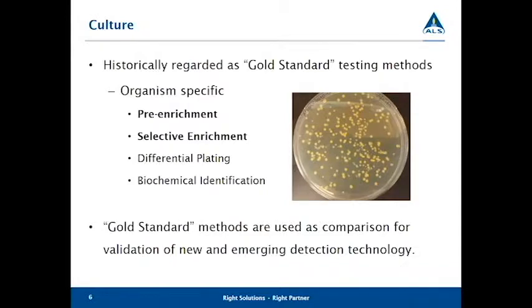The very first technology I'll talk about is culture. Historically, culture has been the gold standard. And as the gold standard, all new technologies and methods are compared to it during the validation process.